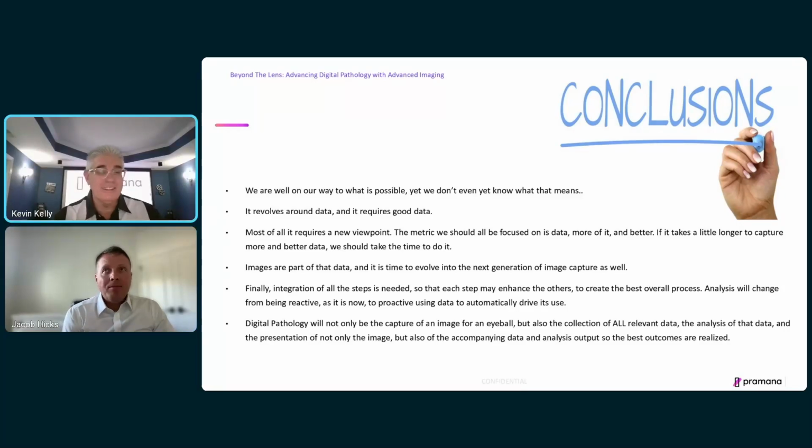So that's a question that only the institution can answer. FDA approval grants the use for digital pathology to be used for primary diagnosis. And if you buy an FDA approved solution, you can do that. You're still going to validate it in your institution to make sure it meets the needs and the processes you want it to do. If it is not an FDA approved solution, there's always other ways that right now, no one actually knows how it's going to shake out. I don't even want to speak to it because I am not an FDA regulatory expert. But we all know that in the past, you could validate and use a system that you validated in your own institution that was not FDA approved. I don't know what's going to happen in the future, so I'm going to leave that one completely alone.